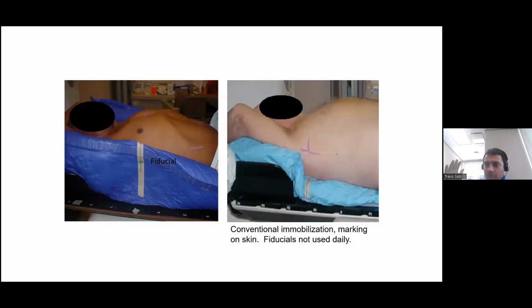You can have larger ones, and at our clinic we have these large blue ones when we're doing SBRT, very high dose per fraction treatments where we need to be very precise and conformal. But we also have these smaller vac blocks for more traditional treatments. If you're giving 30, 25, or 40 fractions, your dose per fraction is not going to be as large, so you can get away with using these smaller vac blocks, which still provide an immense amount of support and precision when you're setting up the patient. They're not as expensive or as cumbersome and large, so they're much easier to store in between fractions, for example.